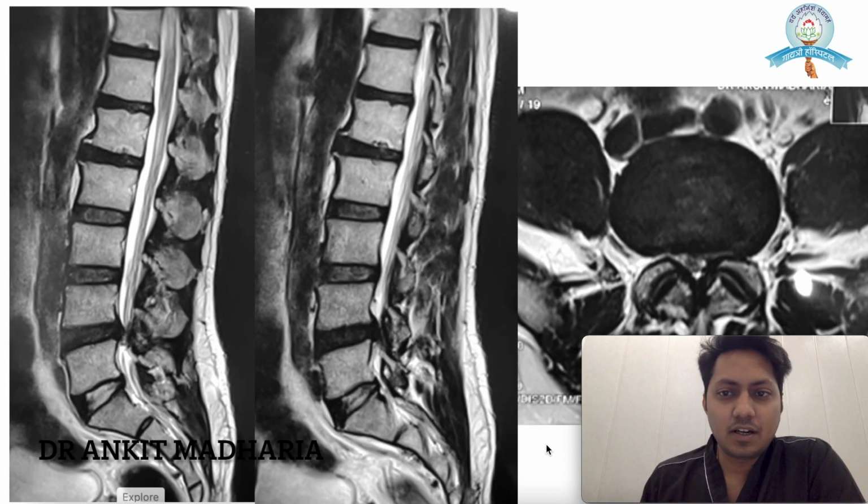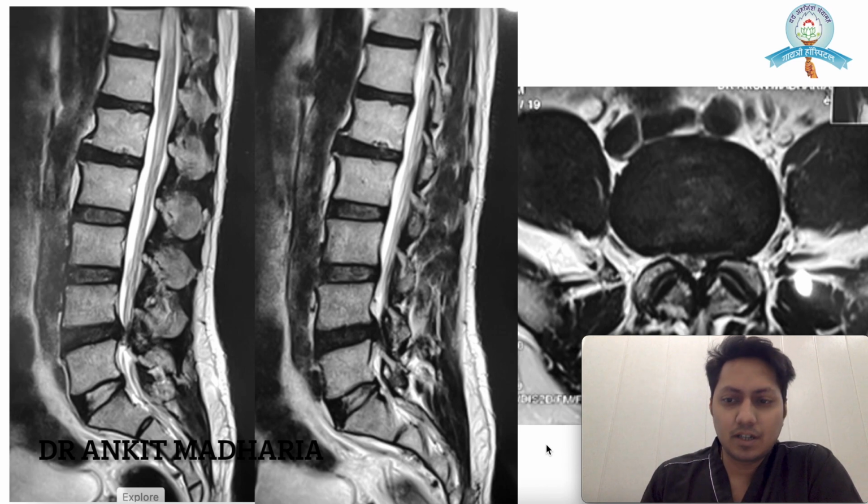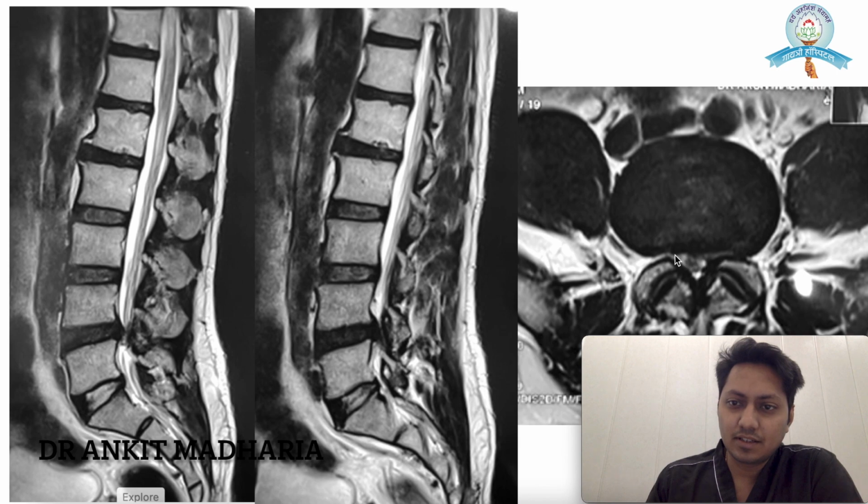These are his MRI, and I'm going to go through his MRI in detail and tell you what my plan is. In these sagittal cuts, he has a bulging disc at L4-L5 level, more on the left side. In these axial cuts, you can notice that he has lumbar canal stenosis at this level, where the disc has been bulging and this foramen has been completely closed by the bulging disc. Also, there is some ligamentum flavum hypertrophy on the under surface of the facet joints, and that is mainly the cause of complaints in this patient.